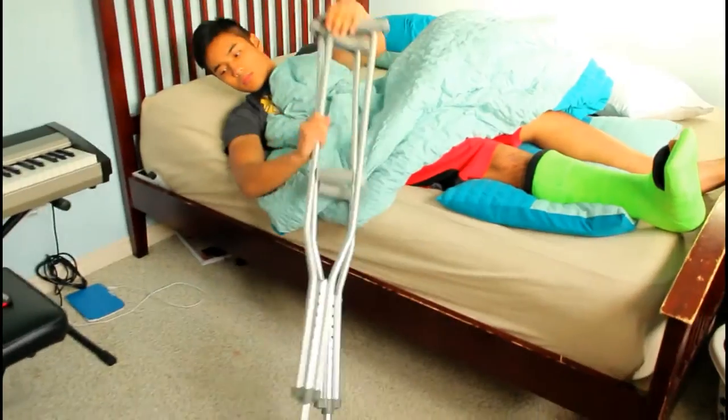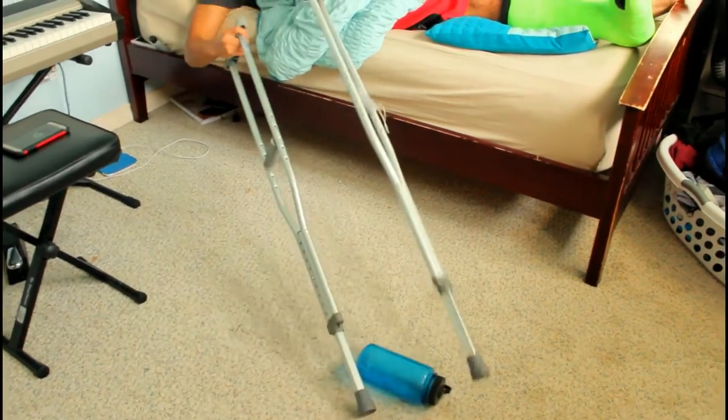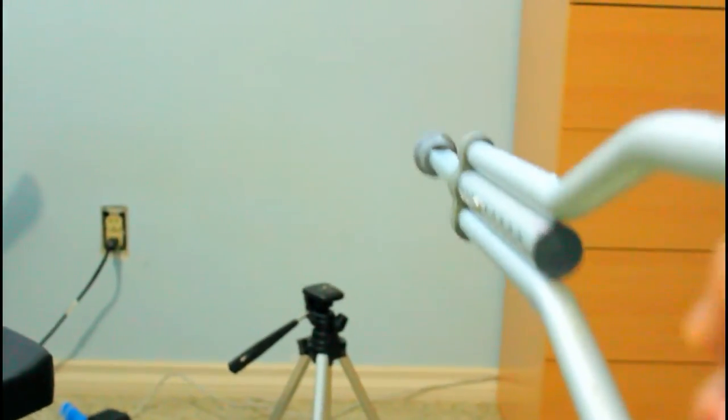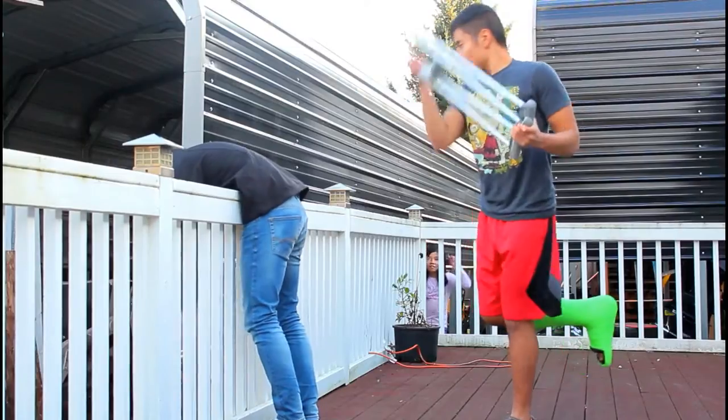Now for some other useful features of having crutches: you can use them as a pair of chopsticks. You can pretend to be a military man. Someone giving you trouble? Fend them off with ease. But remember, only self-defense.